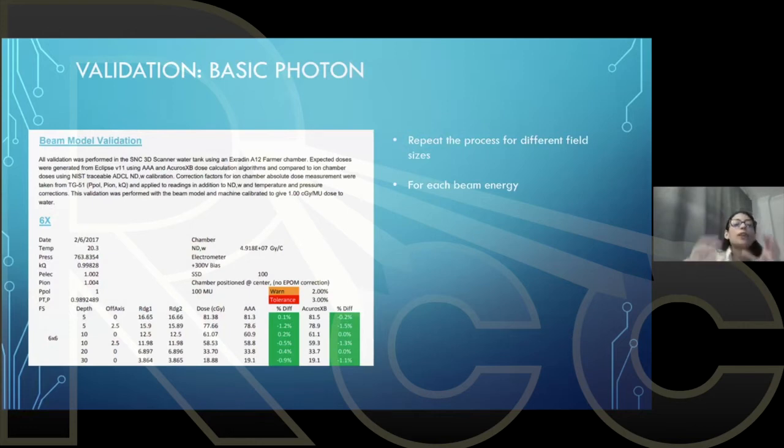And then you are going to do more validation. And then you are going to introduce your MLCs. And then you're going to do some validations. So what happens if you introduce everything at once, the wedges and the MLCs, and you start to do your validations? You don't know from where your errors, if there are any, are coming from. So that's why it's important that you do this implementation step by step.